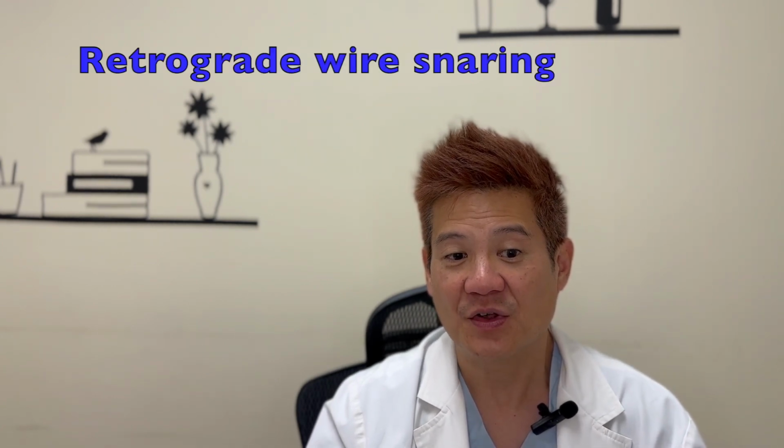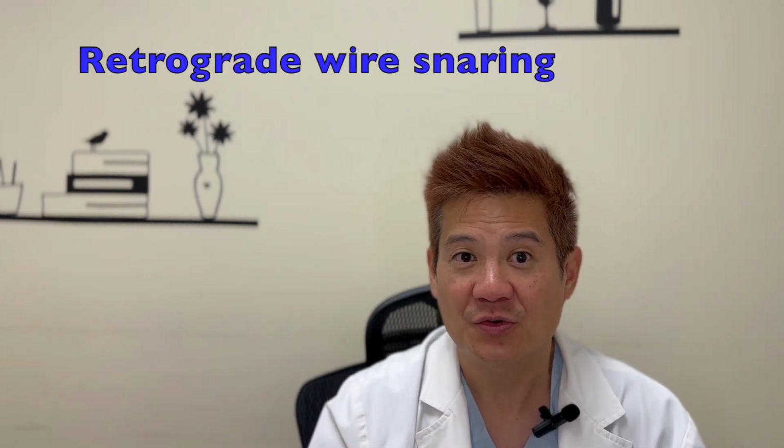Another case is, of course, when we're going through retrograde and we're snaring the retrograde wire. This is really a trap for getting equipment stuck, because if we snare a stiff wire and we pull it into a guiding, that bend on the stiff wire can fail to release from the snare, and you can get a stuck system that can't be pulled out one way or the other.